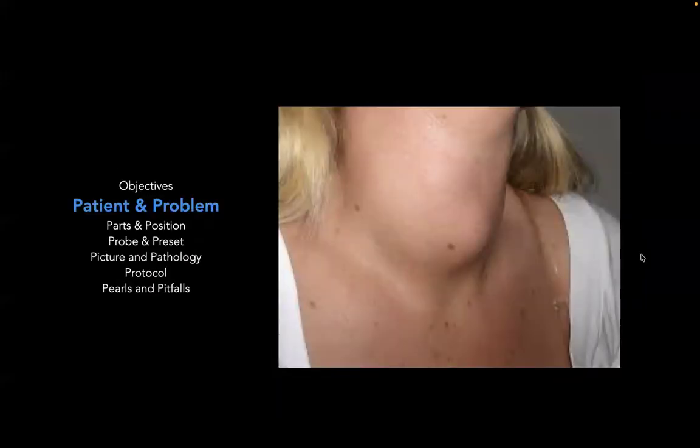The other thing to note is the indication of someone who comes in with a neck lump, and you're wondering, is this neck lump connected to the thyroid or is it not? Does it look like a lymph node, or is it some sort of atypical mass that should require further evaluation? I think POCUS can be really helpful in these scenarios. This is also a great tool when learning where the thyroid is and teaching your medical student, hey, when you're palpating the thyroid, it's actually a lot lower. And you can show them exactly where it is by using the ultrasound probe.